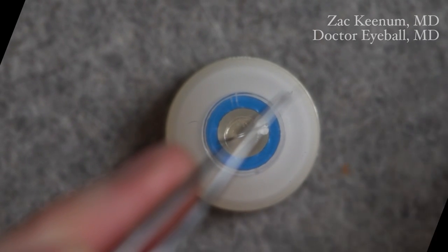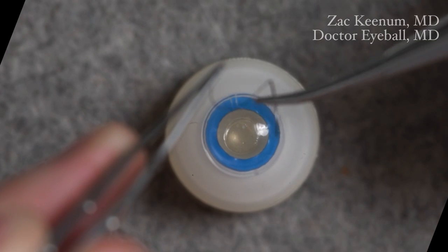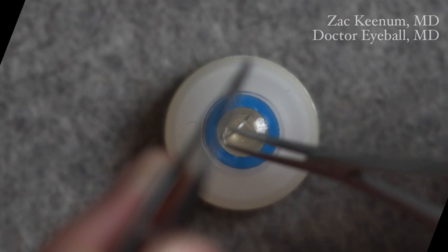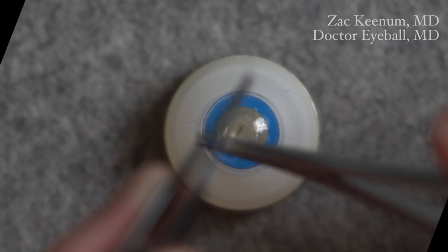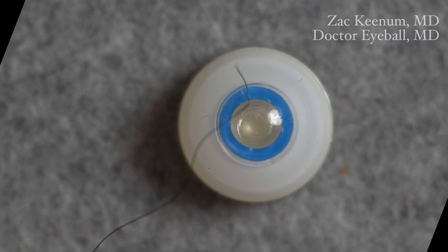First, I want to demonstrate a technique for how to forehand and backhand grab a needle. You can dangle it on the cornea, and depending on which way you push the needle, you can forehand it, or if you pull the needle toward yourself, you're ready for backhand. That's a great way to load the needle when doing corneal suturing.